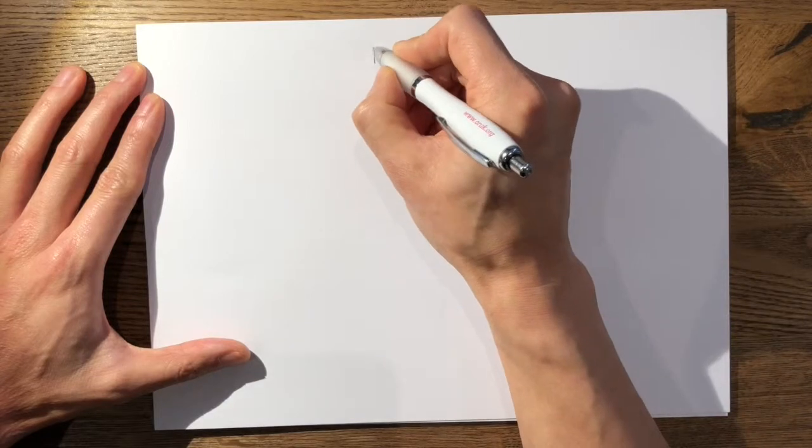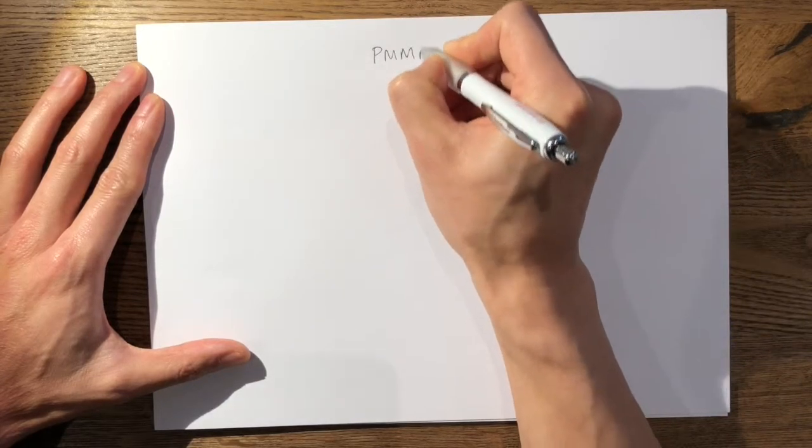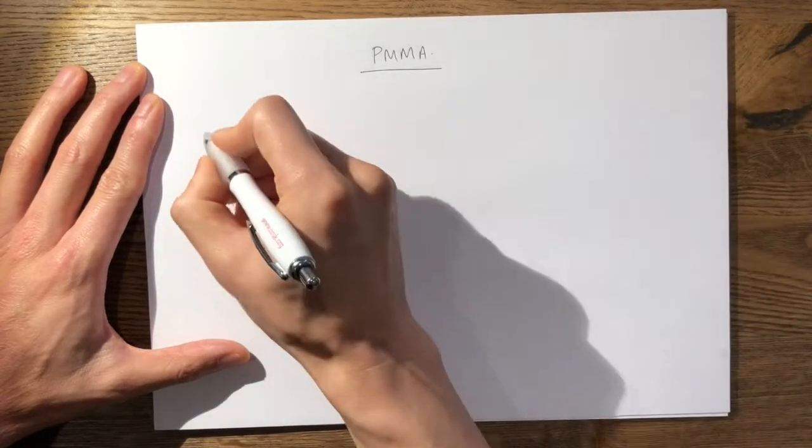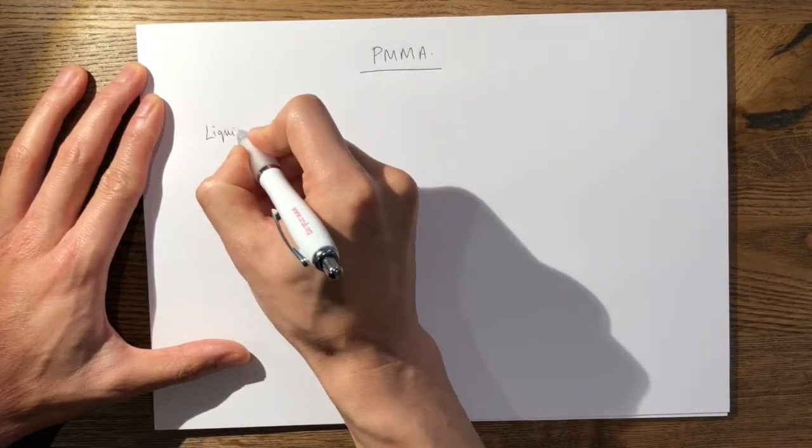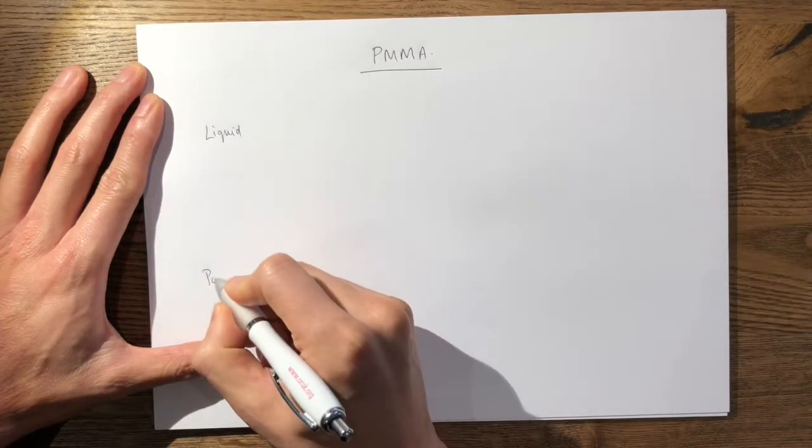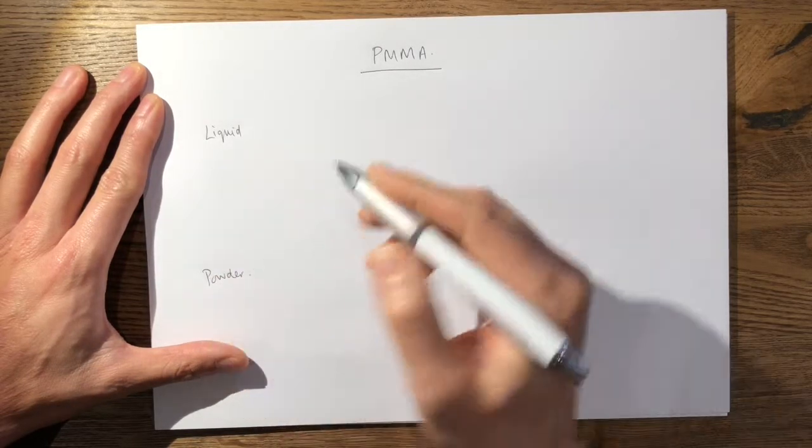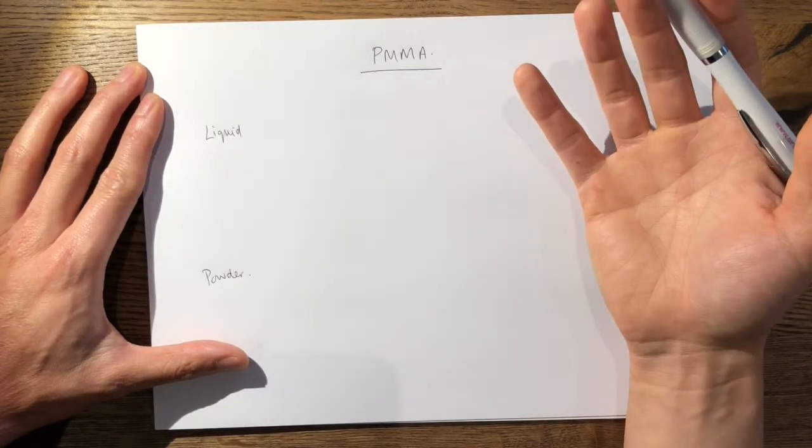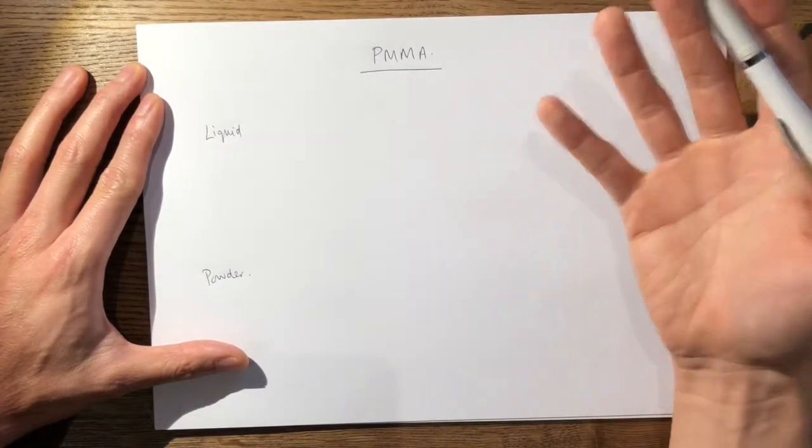So what is bone cement? In its most basic form it's polymethyl methacrylate, which is a man-made acrylic composed of a liquid monomer and a powdered polymer. These components are mixed together which causes an exothermic reaction to reach your final product.